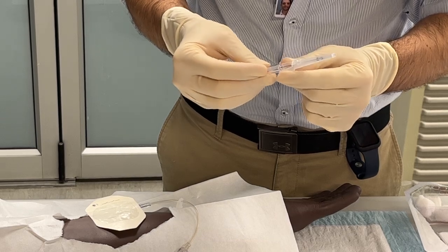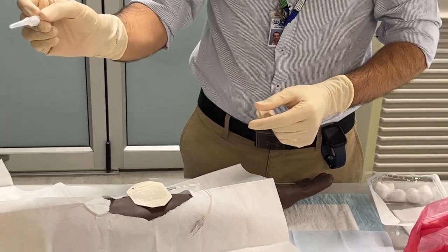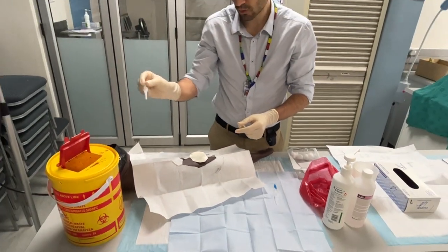So please don't ever recap your needles — just discard them directly into the sharps container, which should be next to you.